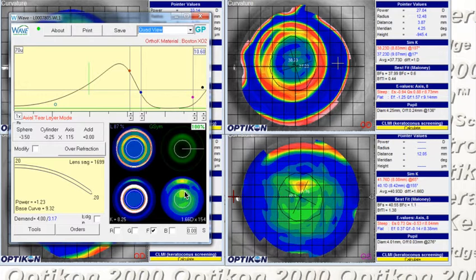And in this case, we're molding out just about all of it. We'll notice in the refraction there's actually a little bit of against-the-rule cylinder, which indicates there's a fair amount of internal astigmatism. So this is a case where we can see how astigmatism that's located very close to the apex can be molded out with a spherical lens.